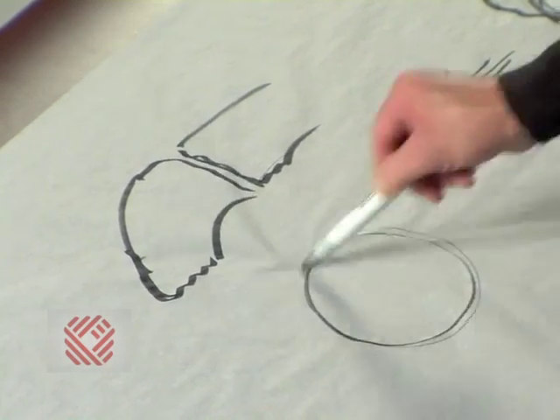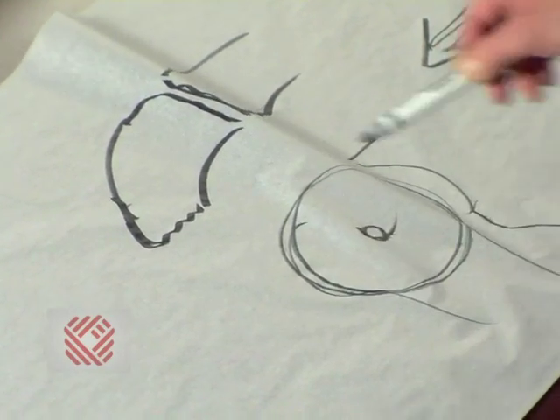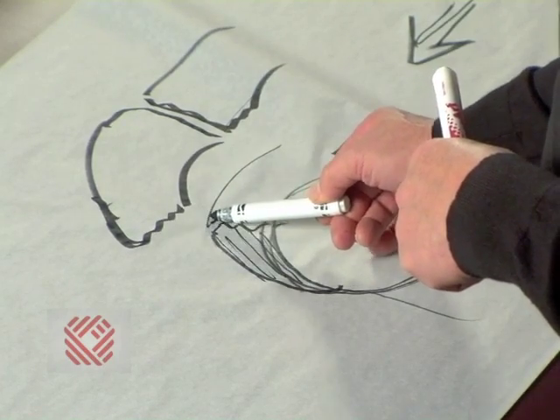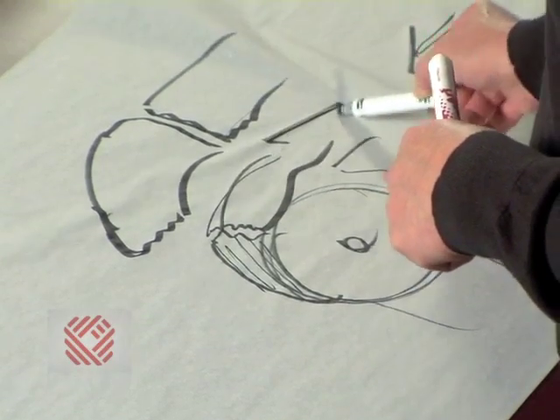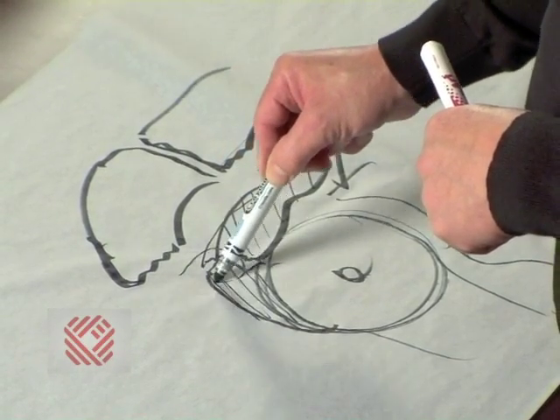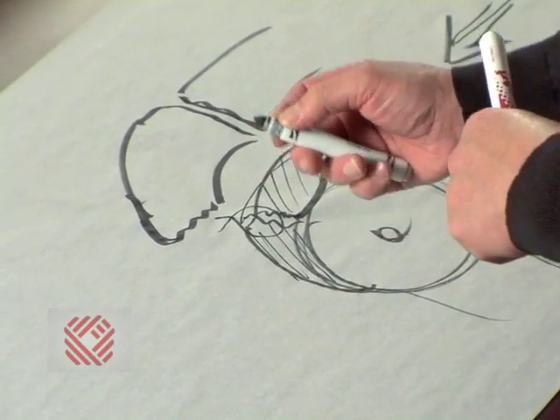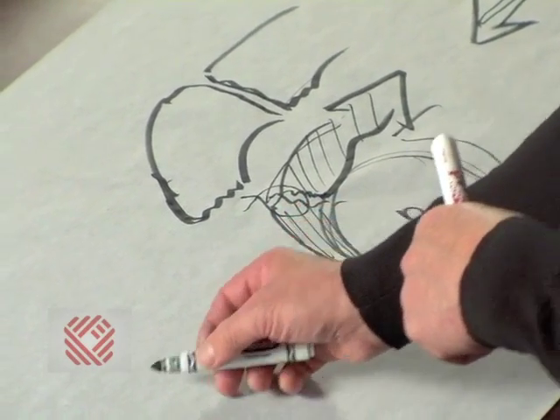Then we have to repair the tendon. We repair the tendon by first advancing the torn piece so that the ends approximate, then putting some stitches in to hold them together, and then using a device that we call a bone anchor screw.